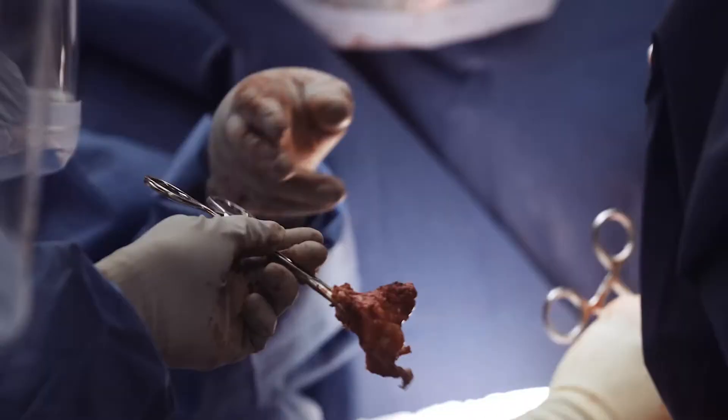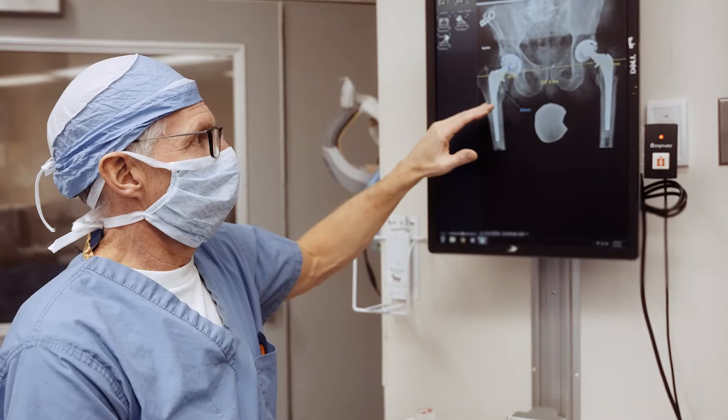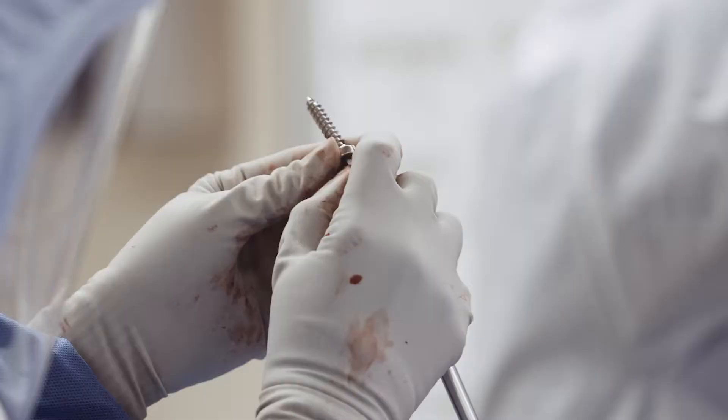We'll also bring the head down because of the eccentricity, so that'll effectively give him a little bit more length. I'm not concerned about leg length inequalities at this point because he's getting a custom tri-flange on the other side, and that will be sorted out at that point.